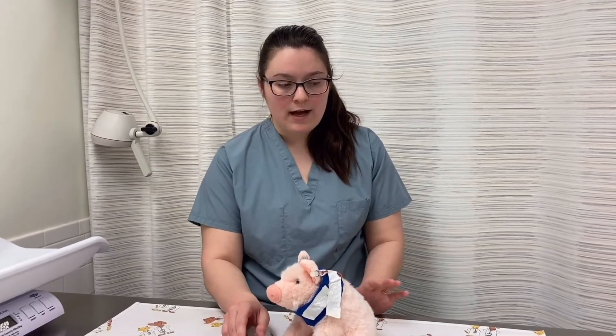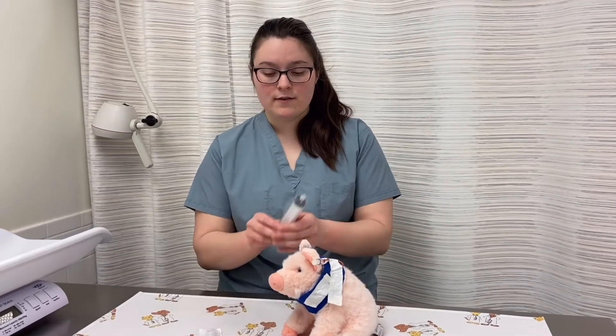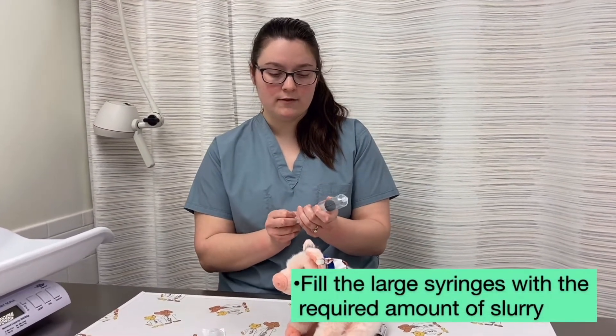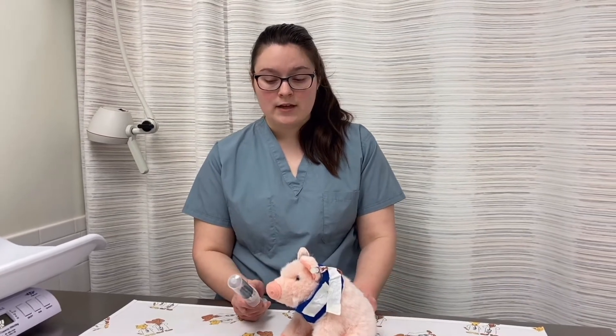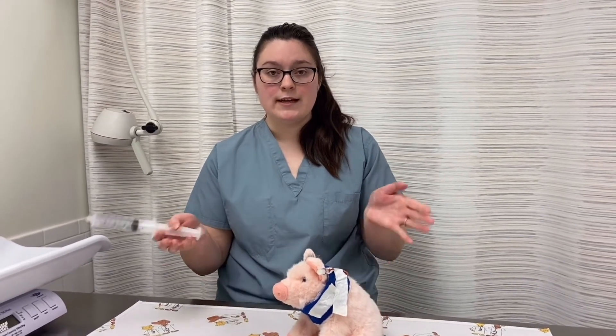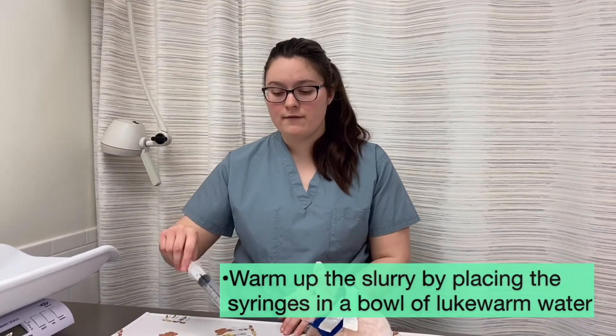When you have the food, you're going to want to warm it up before a meal. Take the syringes filled with food to the total amount you want to give for each feeding. Then get a big bowl, take lukewarm water, and have all of the syringes filled with food submerged in that water.